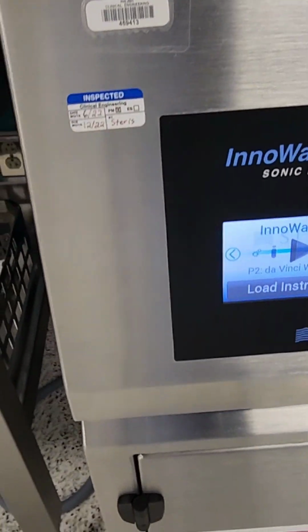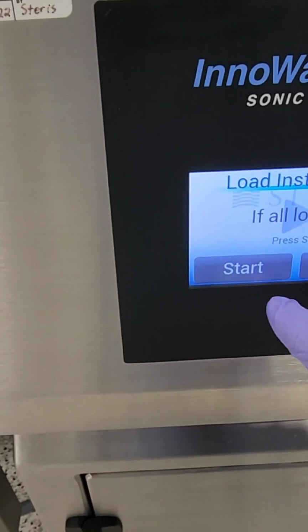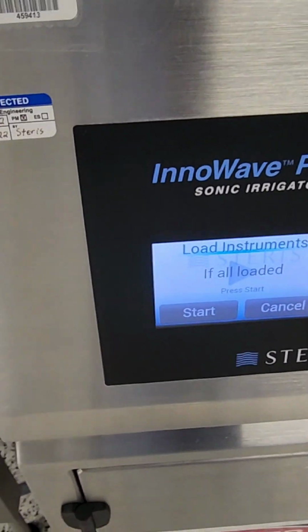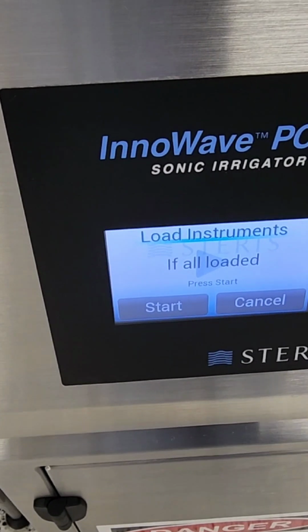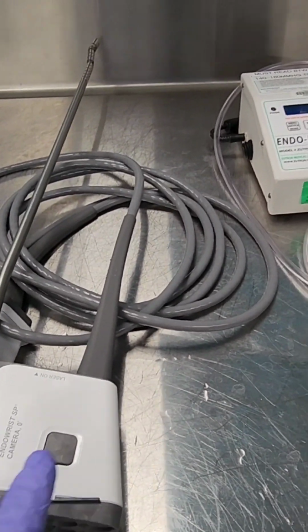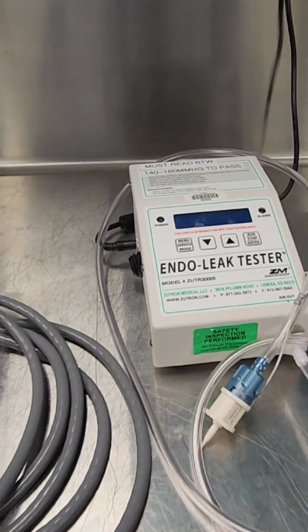All right, and then once completed and clean, we're gonna go ahead and open our ultrasonic up. All right, so we have that ultrasonic loaded up. We have selected the cycle, and then we're gonna hit the start button, and the ultrasonic will do its thing. Once it's done out of the ultrasonic, there is a leak test that needs to be performed on this device.